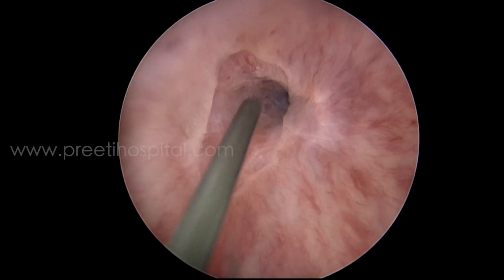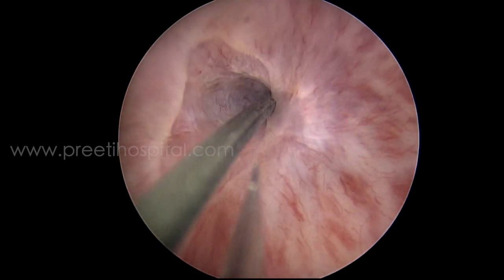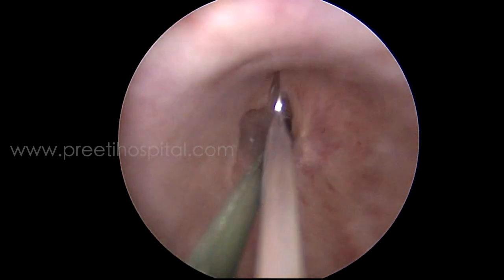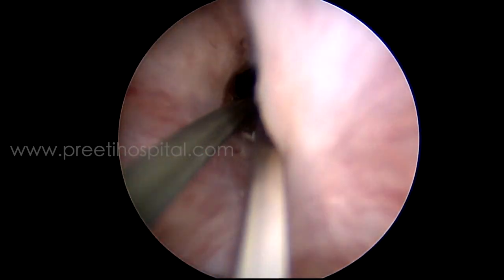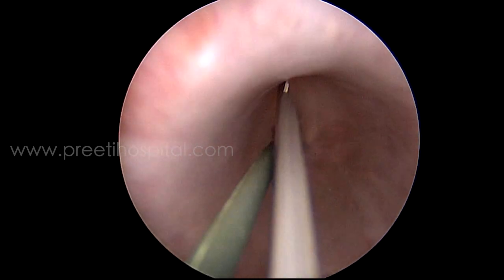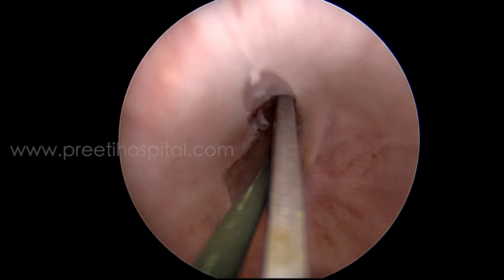First, if you pass a Terumo guide wire through the working element, it really makes life easy. I am sharing this video for the juniors — don't casually attempt to do OIU without passing the guide wire first. The advantage of the Terumo guide wire is that it somehow negotiates into the correct route.